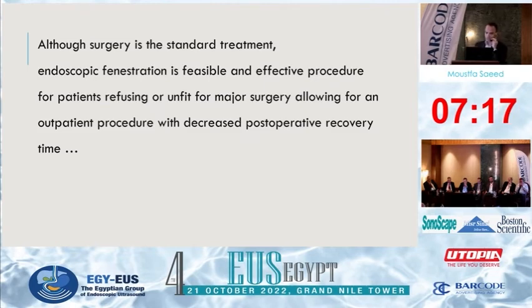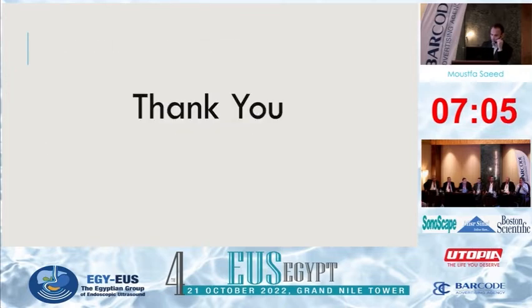Also, surgery is a standard treatment. Endoscopic fenestration is a feasible and effective procedure for patients refusing or unfit for major surgery, allowing for an outpatient procedure with decreased post-operative recovery time. And thank you.